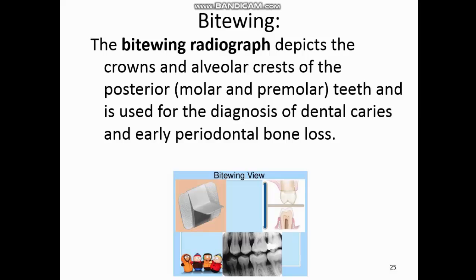The next type of intraoral radiography is the bite-wing view. The bite-wing radiography is a commonly used intraoral imaging technique in oral and maxillofacial radiology. The creation of an ideal and diagnostic image is challenging and depends on good technique. The bite-wing radiograph is an image that depicts the maxillary and mandibular crowns of the teeth, providing a clear image of the interproximal surface of the tooth and allowing for detection of interproximal caries.